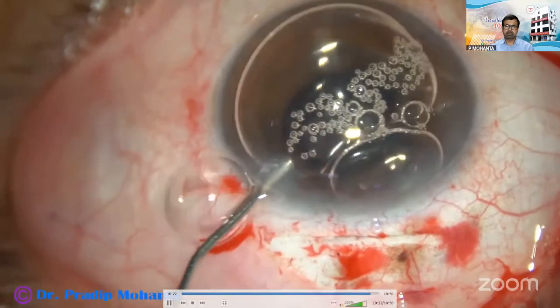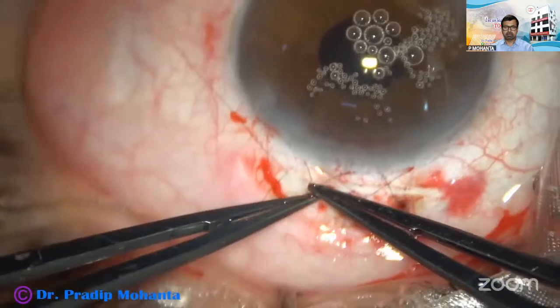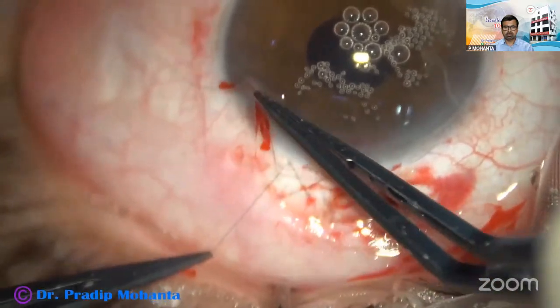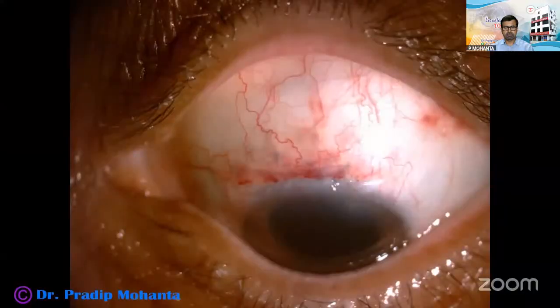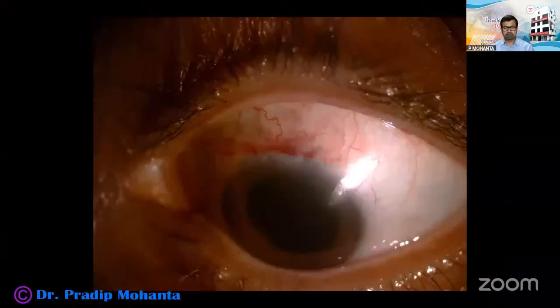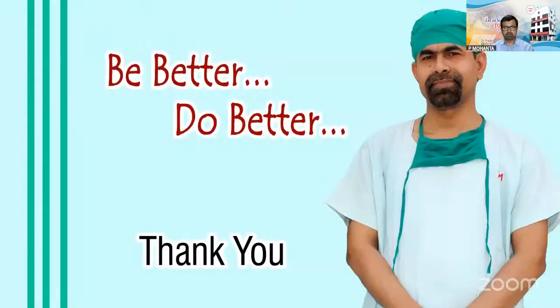And whenever there is a posterior capsular rent, we should suture the wound, even if the wound appears very nicely sealed. And this is the postoperative picture. The patient got 6/12 vision unaided, and the patient was happy. Thank you very much for your attention.